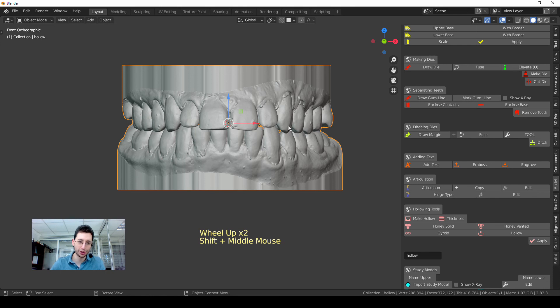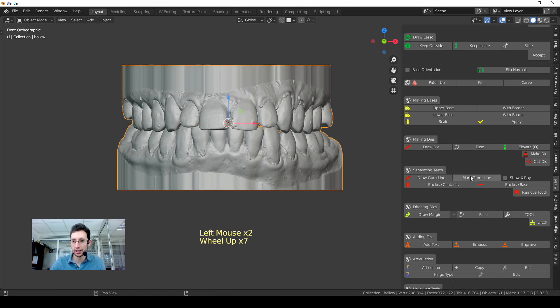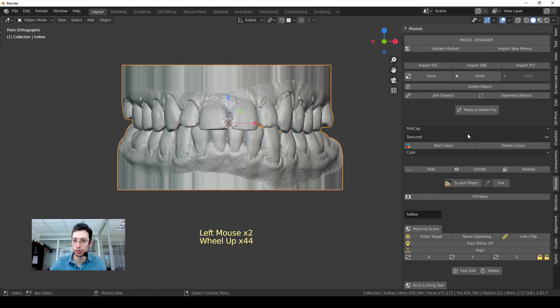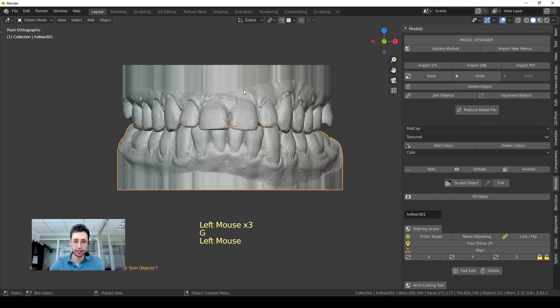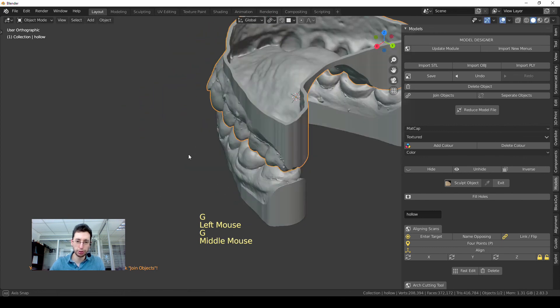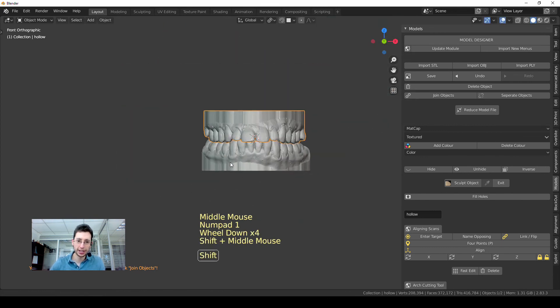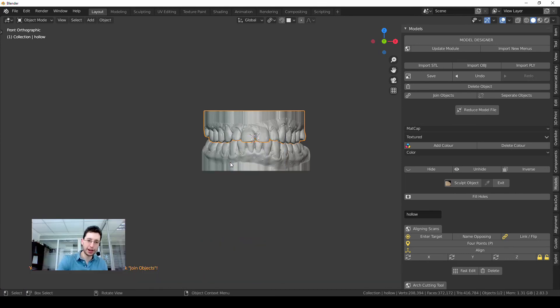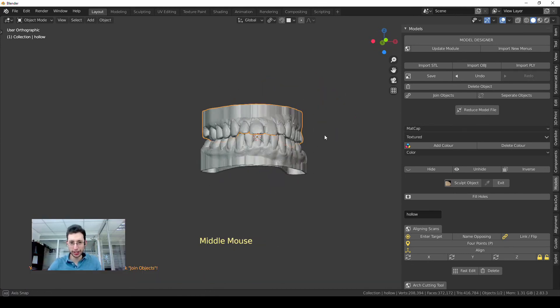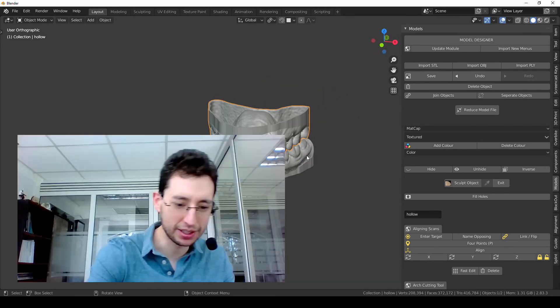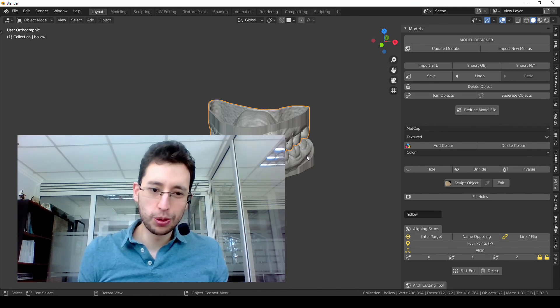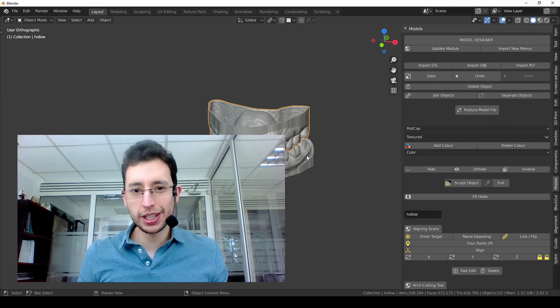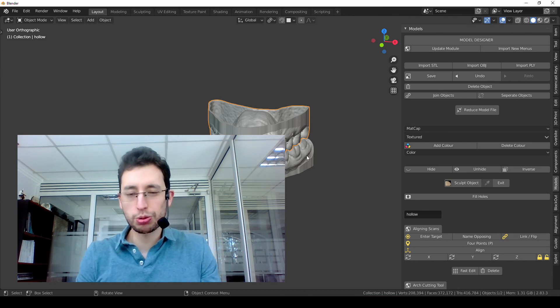However, if you print this, both models are going to be fused. So the last thing to do is to separate both models using this tool which says Separate Objects. And now I have again a lower and an upper model, and that's it. Very easy and we have a very clean model ready to be printed. Very easy. Okay, so I hope you enjoyed this video. It was very short but very useful.